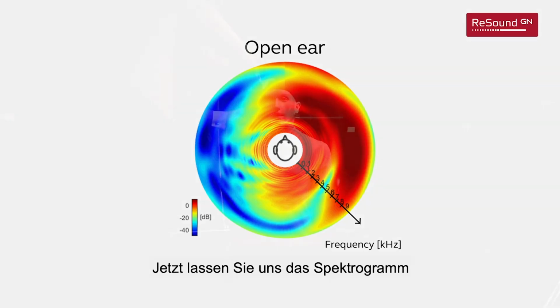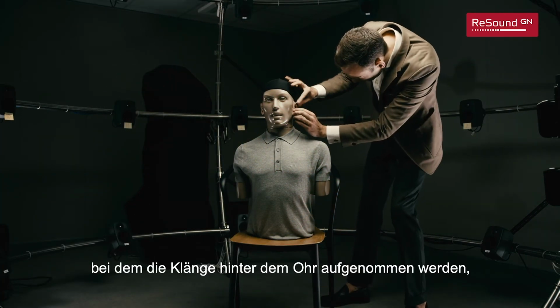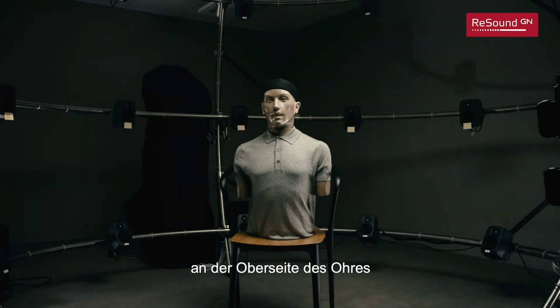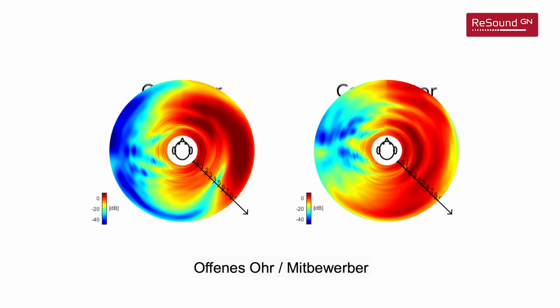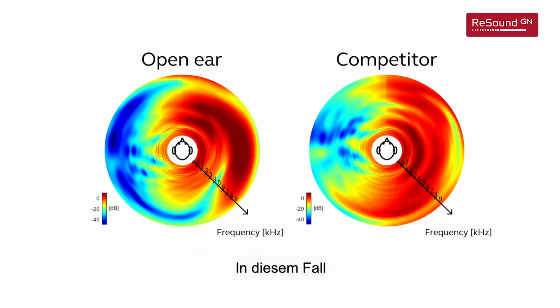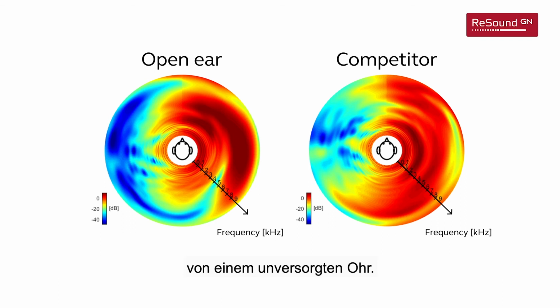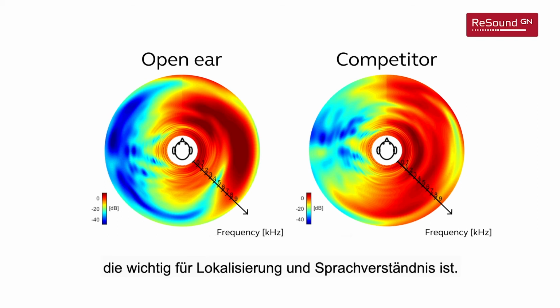Now, let's record the spectrogram with a traditional hearing aid, where the sounds are collected behind the ear as the microphones of the hearing aids are placed on the top of the ear and not inside the ear. In this case, the spectrogram from a traditional hearing aid differs from an unaided ear. It makes the user lose some of the spatial cues important for localization and speech recognition.